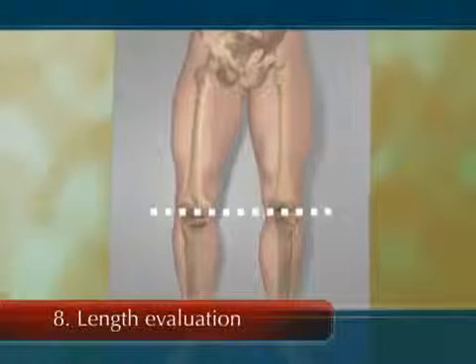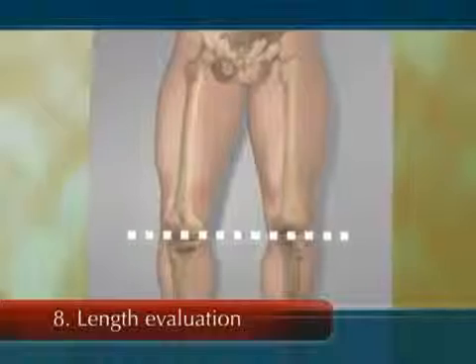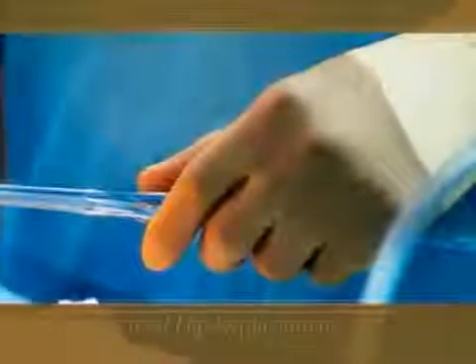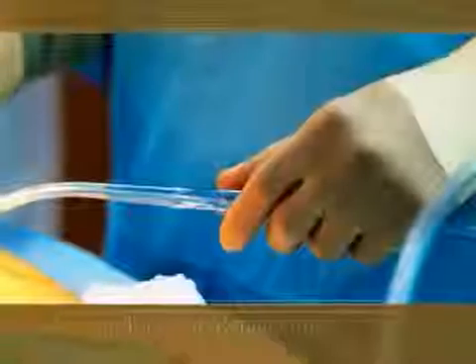Prior to final assembly of the total hip, leg lengths are again evaluated. The new implants will replicate your hip joint. Your physician will rinse out debris from the hip joint with sterile fluid and then close the wound in layers with stitches and/or staples. A plastic drain may be placed in your hip and removed later.